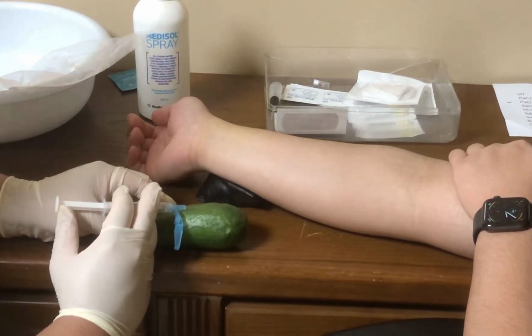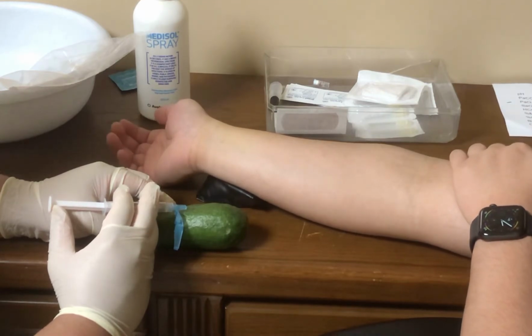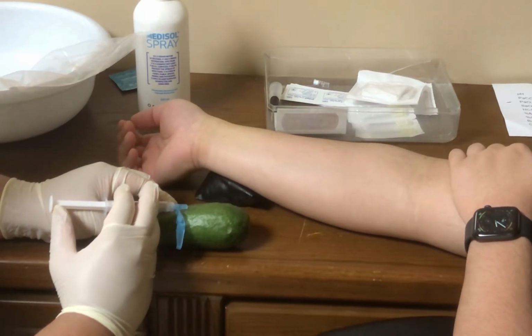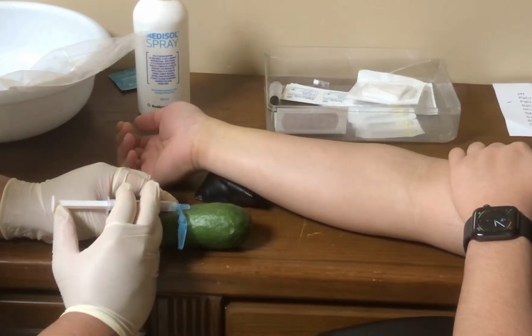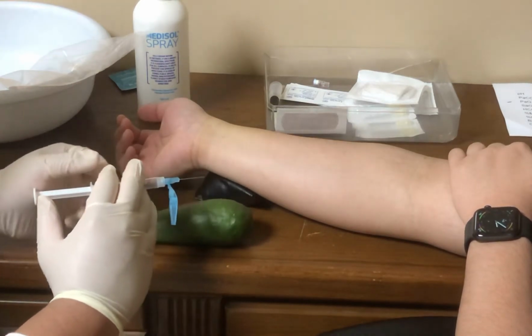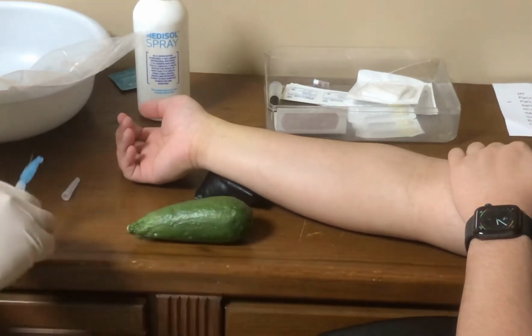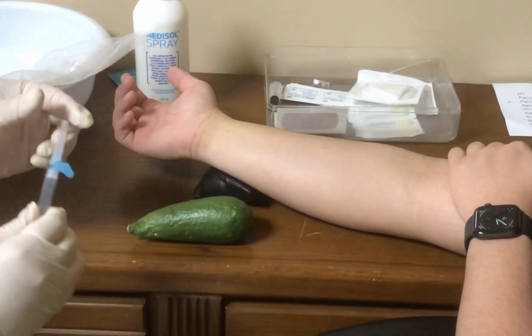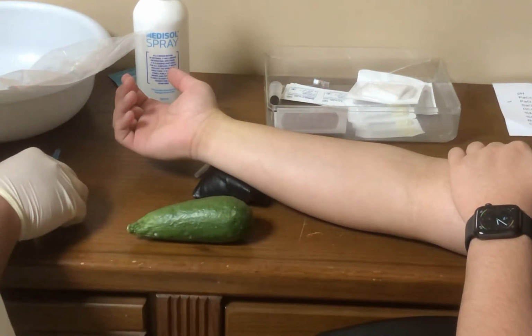So you need to obtain at least 1 to 3 ml of specimen. This amount allows for rechecking and additional studies if necessary. After this, withdraw the needle while stabilizing the barrel of the syringe. This prevents any inadvertent aspiration of air that can alter the specimen. After this, recap the syringe by doing this. Or with syringes like this, you can just simply cover this and set it aside.